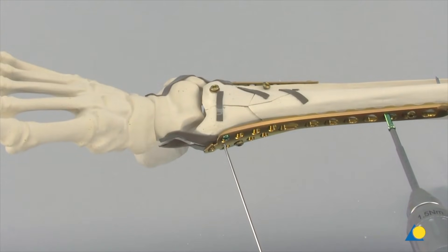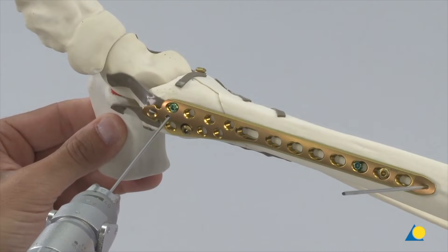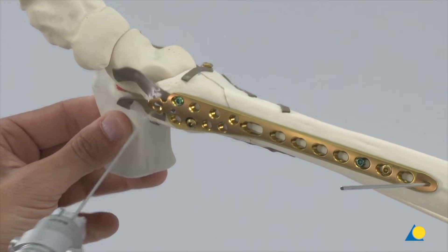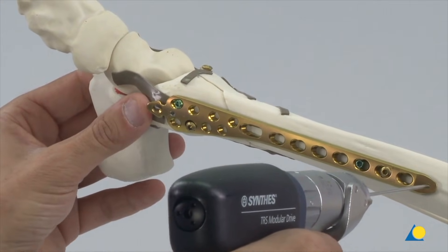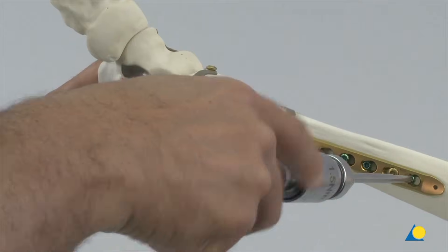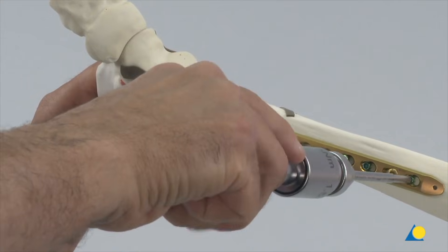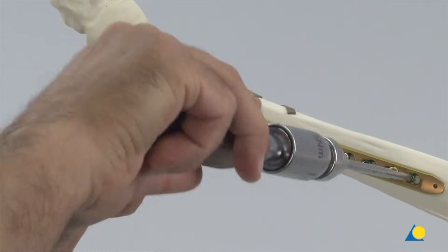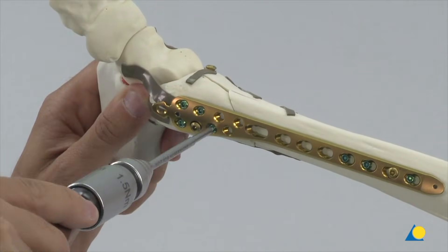This screw insertion procedure is repeated to insert a locking screw proximally. Once the locking screws have been placed distally and proximally, the fracture is fixed and the K wires are now removed. Further locking screws are inserted proximally and distally as necessary. Final tightening is done manually with the torque-limiting screwdriver to prevent any over-tightening or jamming of the screw. An audible click indicates that the limit of the torque has been reached.